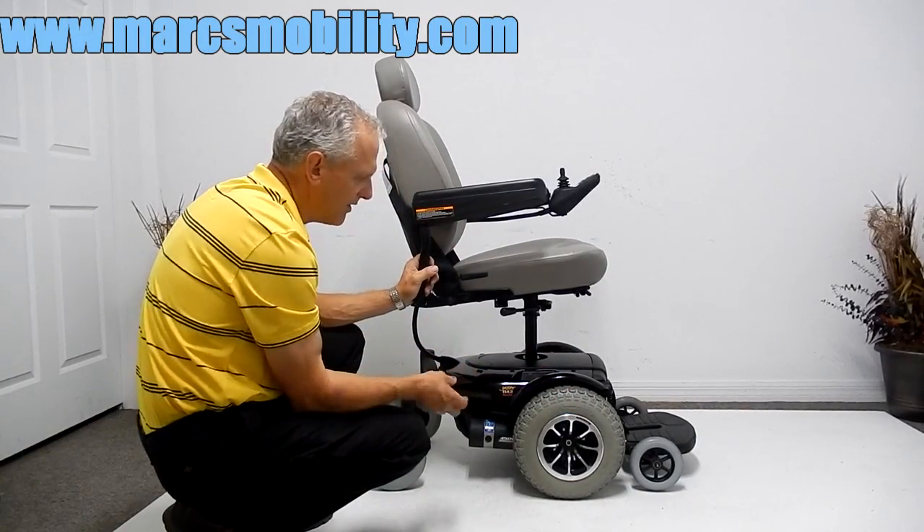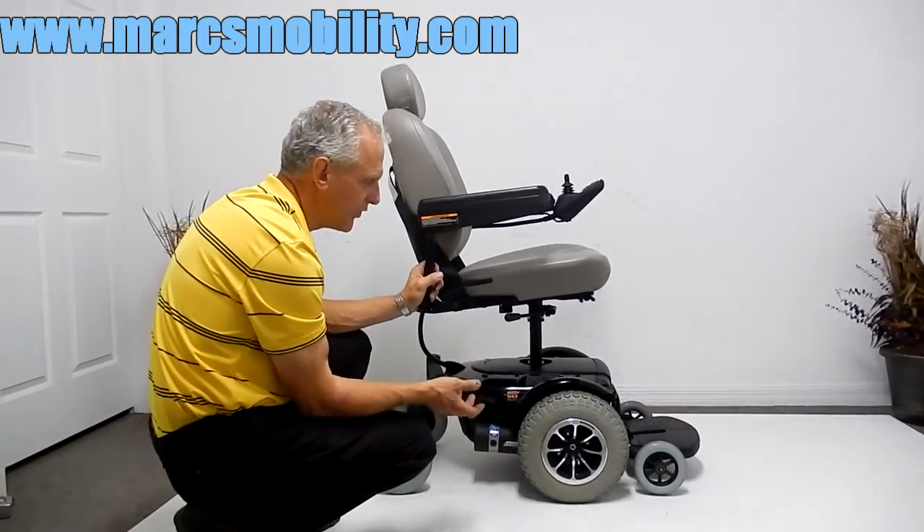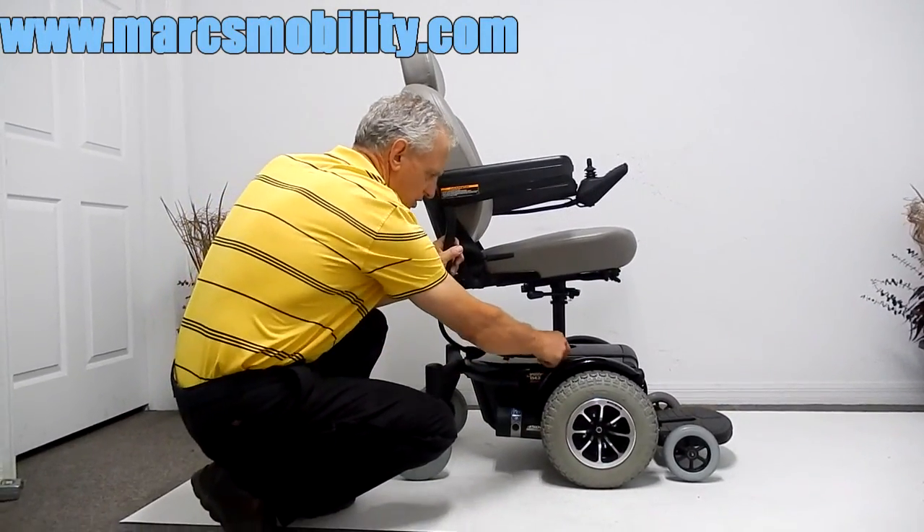This is not a golf cart, but if you need a power chair that will go through grass, some dirt, and some hard dirt, this would be the one — especially with the seat lift.